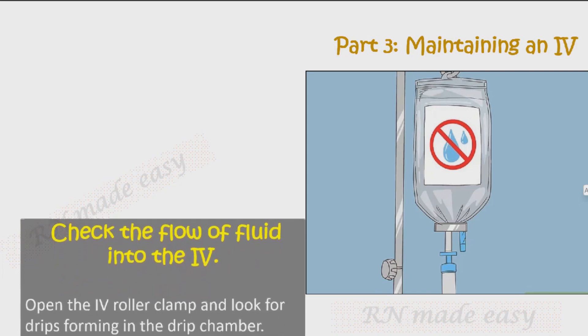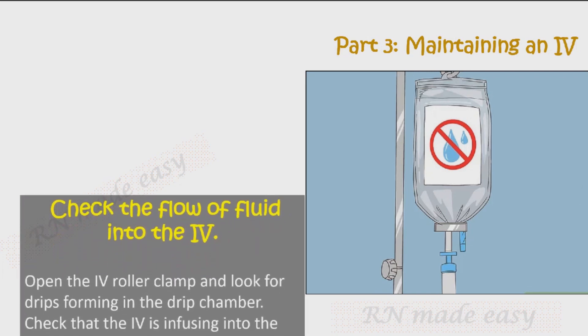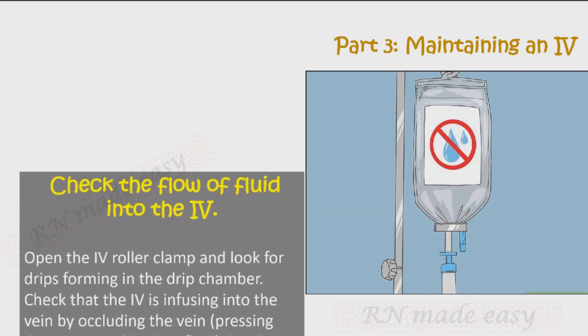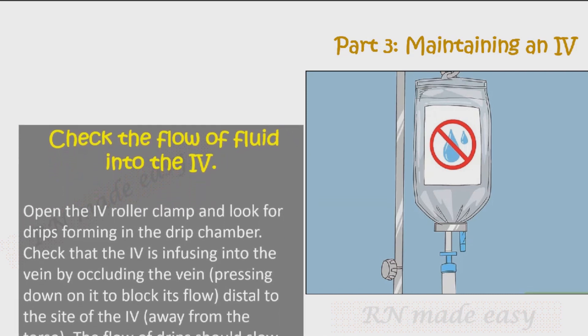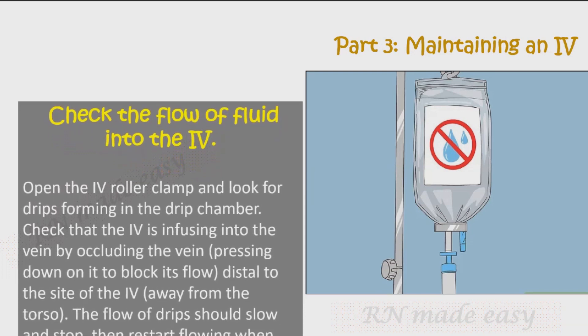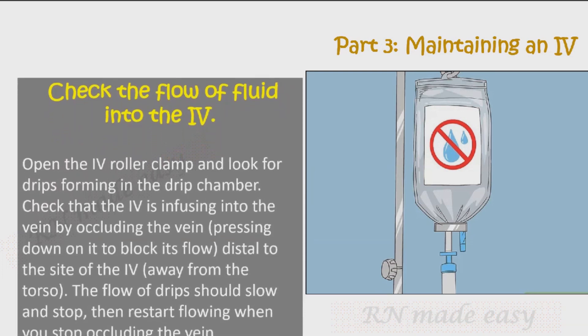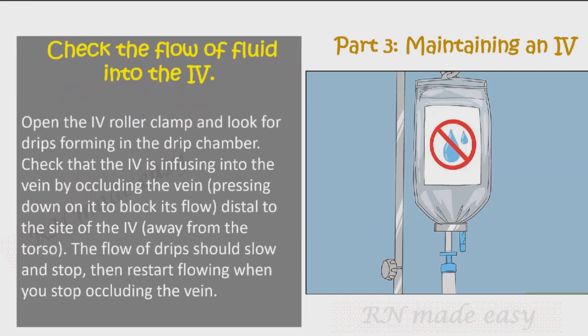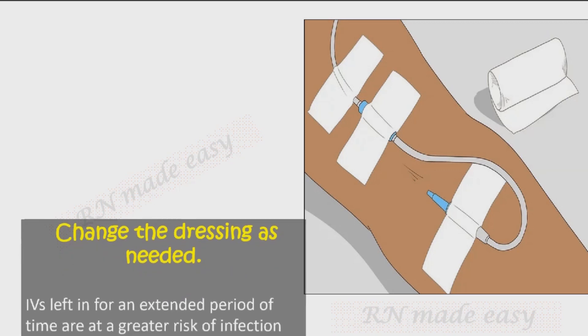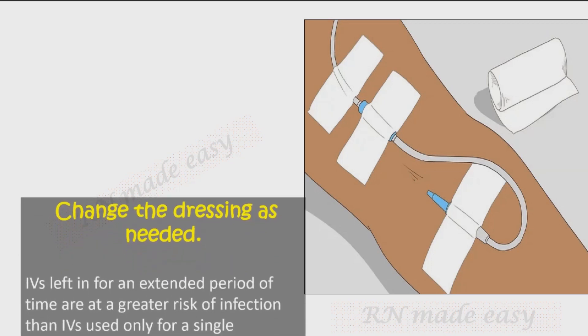Check the flow of fluid into the IV. Open the IV roller clamp and look for drips forming in the drip chamber. Check that the IV is infusing into the vein by occluding the vein — pressing down on it to block flow distal to the IV site, away from the torso. The flow of drips should slow and stop, then restart flowing when you stop occluding the vein.